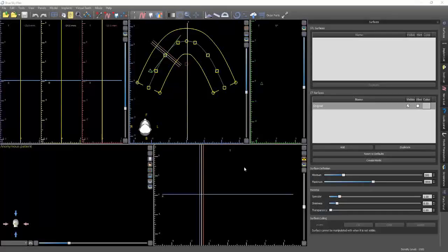Hey guys, Baron Grutter here. In this video, I'm just going to go over the use of the cephalometric analysis utility of the software. It's pretty straightforward, so we're not going to have to make a bunch of videos over this. I'm just going to make one for now, unless we feel there's a need in the future if anyone asks for more detail.